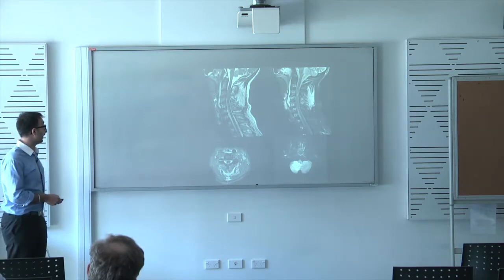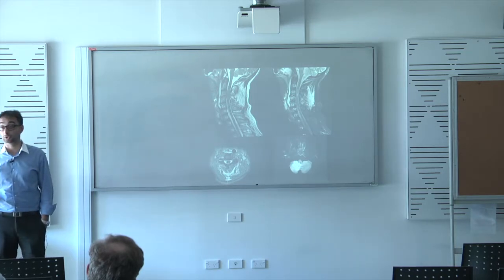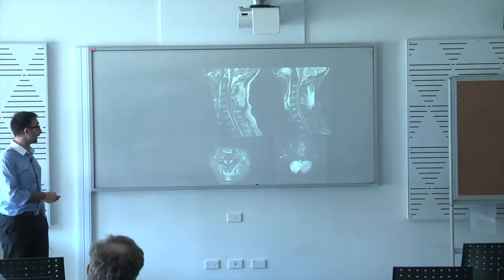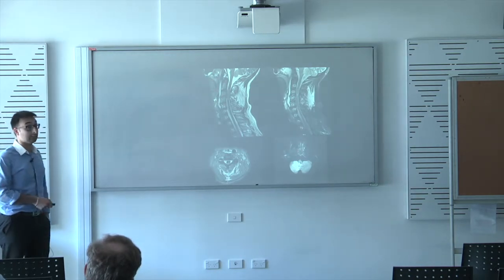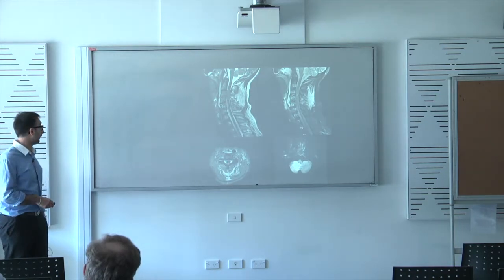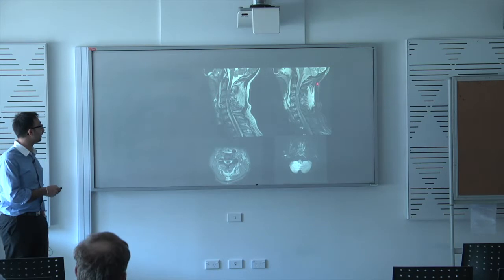And you can see this is a diffusion-weighted sequence of the brain, and it's the most sensitive sequence to look for stroke. It'll pick it up within minutes. It shows you there's an area of high signal on the DWI in the right cerebellum, which fits with an acute stroke in this setting. There's also a pre-vertebral hematoma here, and they've obviously done some damage to the posterior soft tissues.